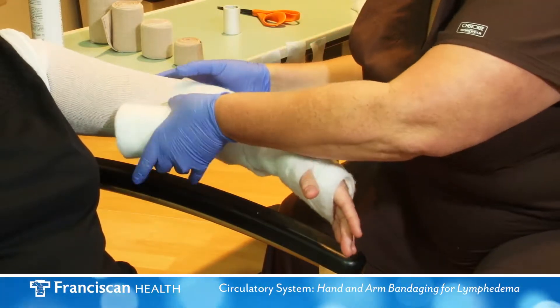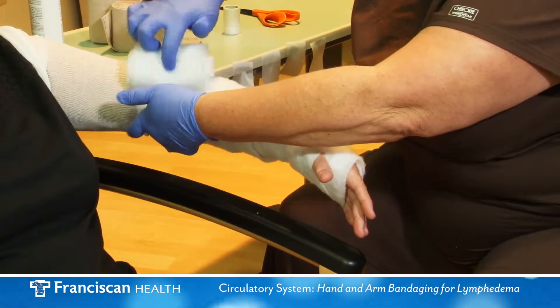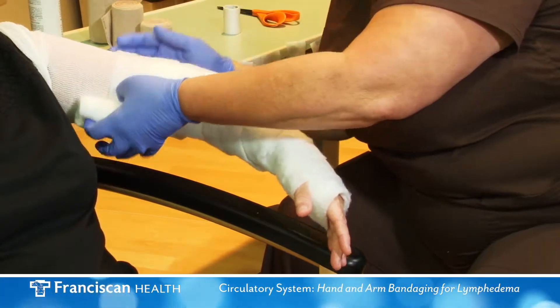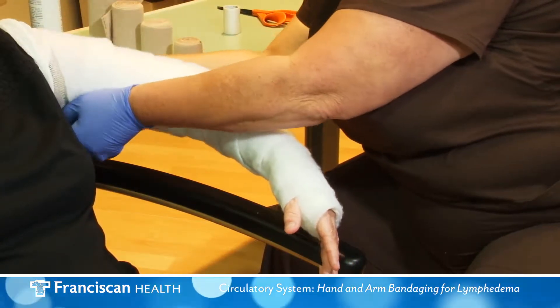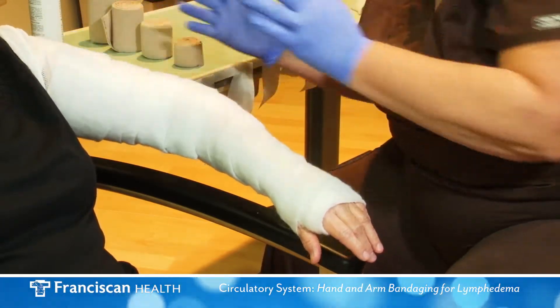Apply double padding for added protection to the inside of the elbow. Be sure to maintain a slight bend at the elbow while bandaging. If one padding bandage is not enough to cover the arm, use a second padding bandage.